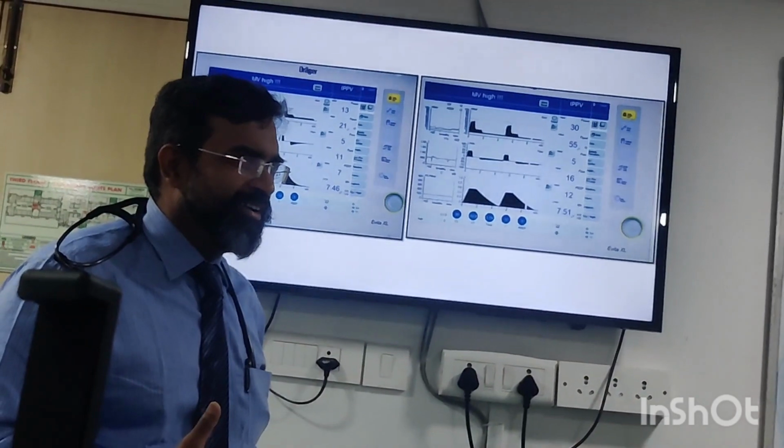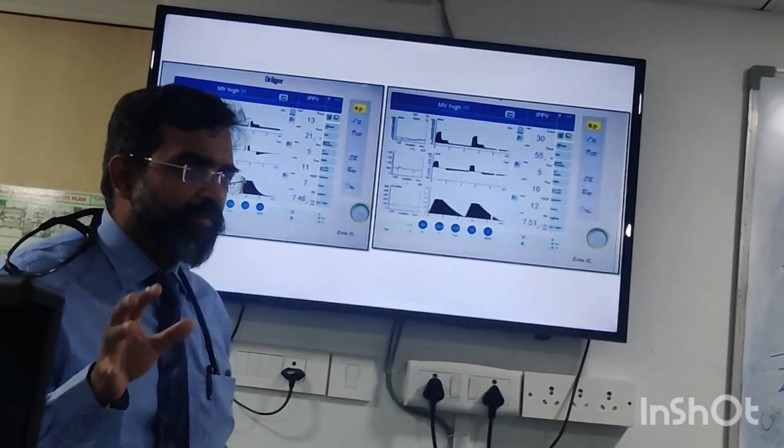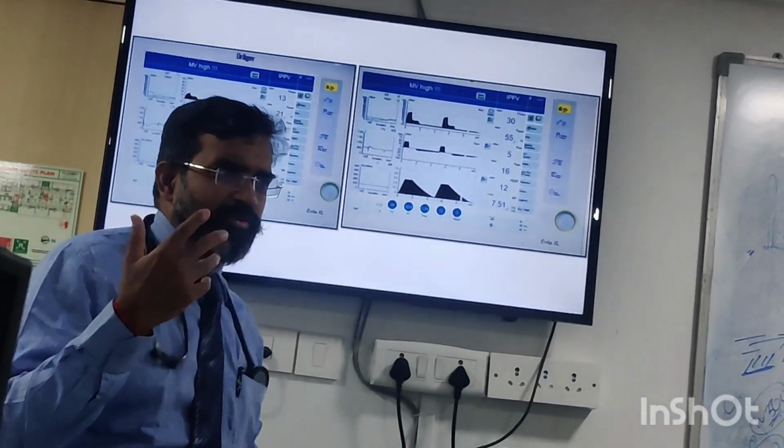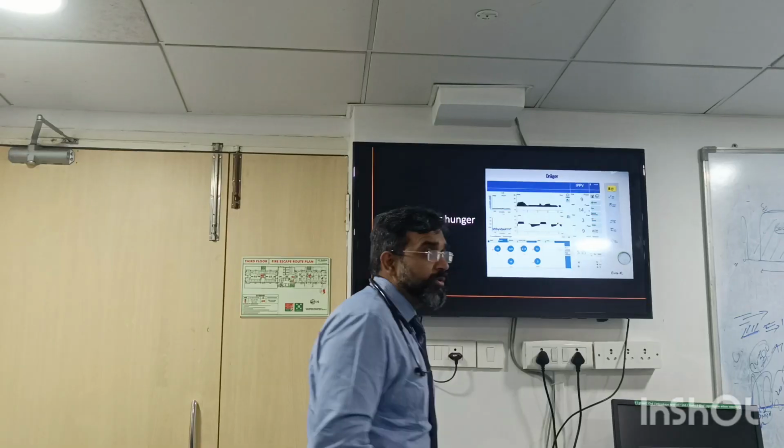Are you understanding? So this is dynamic hyperinflation automatically generated. Yes, dynamic hyperinflation causes auto PEEP. Use whatever you want. You can call it that. Clear? Now look at air hunger.